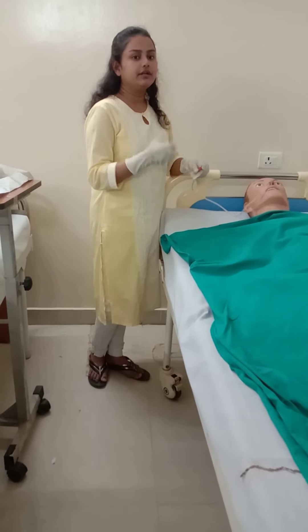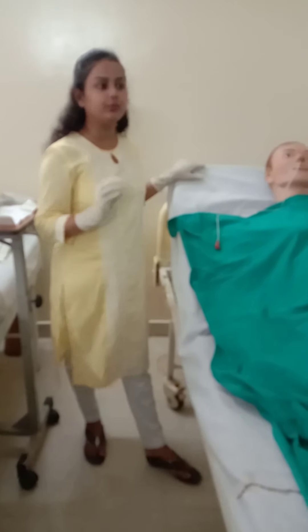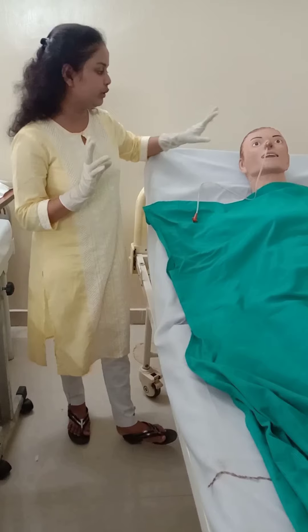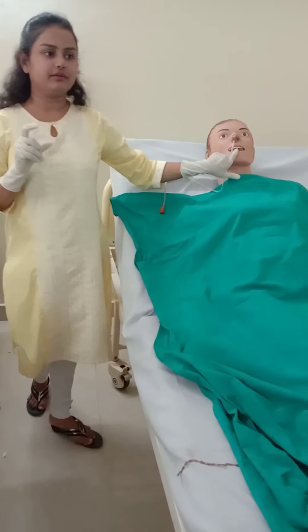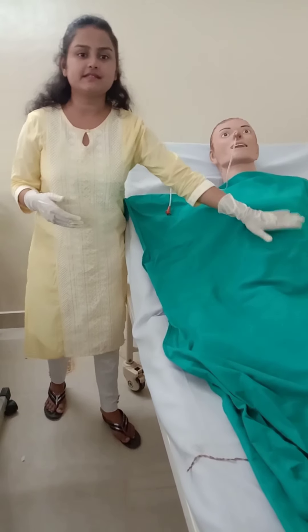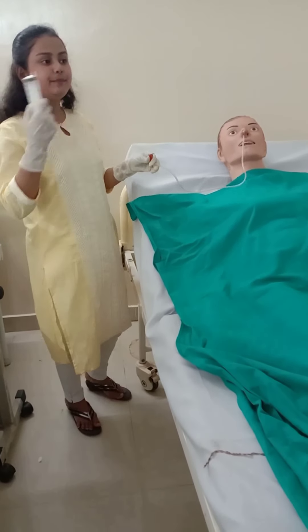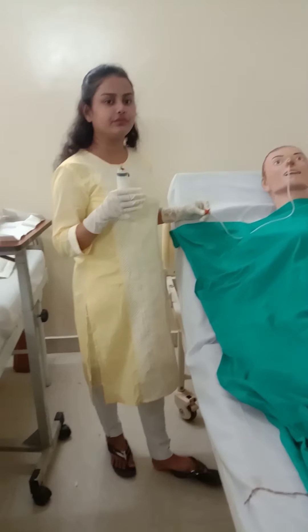Now I will explain how to give feeding through the Ryle's tube. Before giving feeding, always make sure the patient's head is elevated 30 to 45 degrees and the bed is elevated. Confirm that the Ryle's tube is in the stomach using the same verification techniques. Always aspirate prior gastric content first — if there is more than 30 ml of gastric content, do not give feeding. If it is less than 30 ml or 50 ml, you can proceed with feeding.